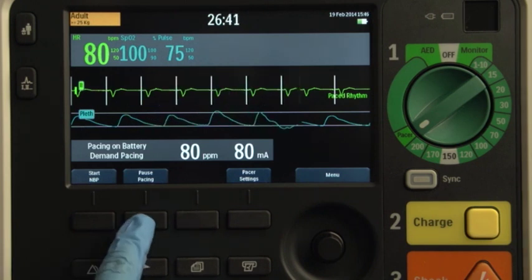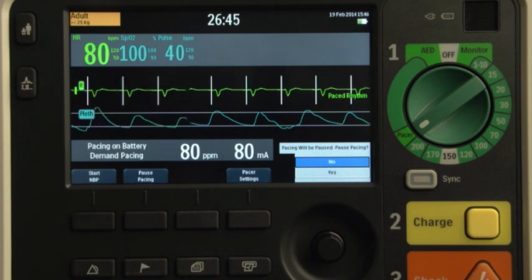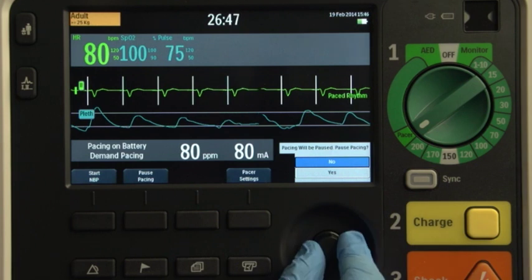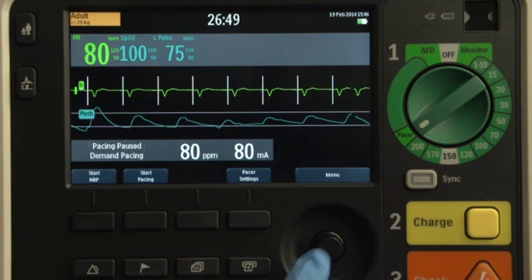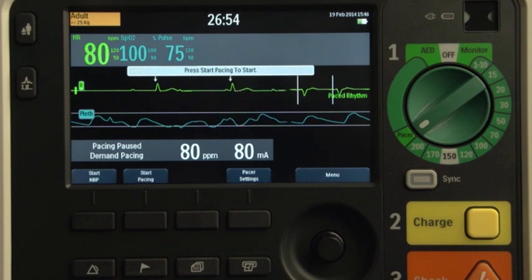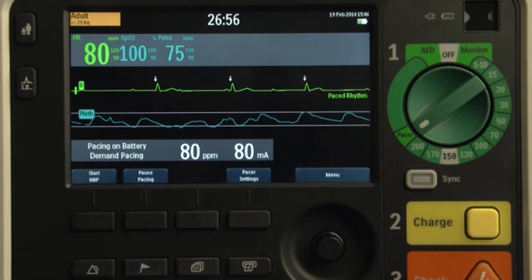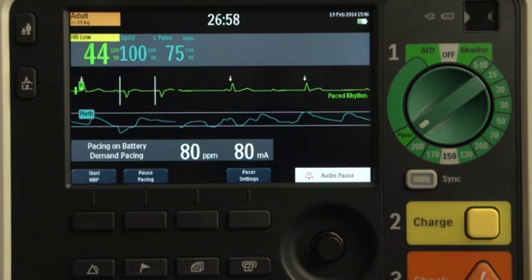To stop delivery of paced pulses, press the pause pacing soft key. A prompt message asks you to confirm your action. Using the smart select knob, select yes to pause pacing. Press the start pacing soft key to resume pacing, or move the therapy knob away from the pacer position.